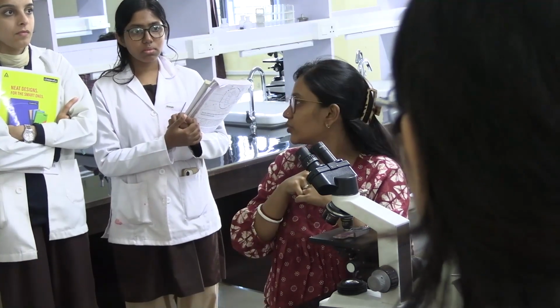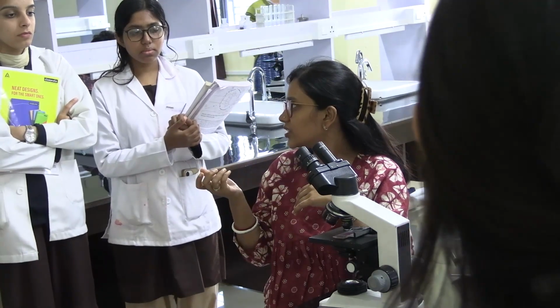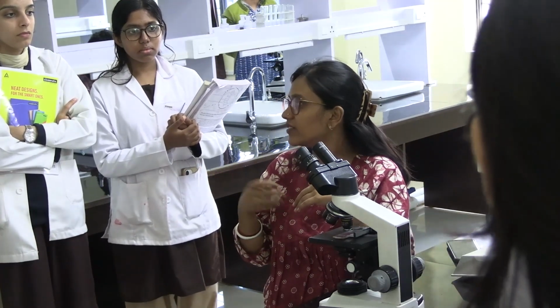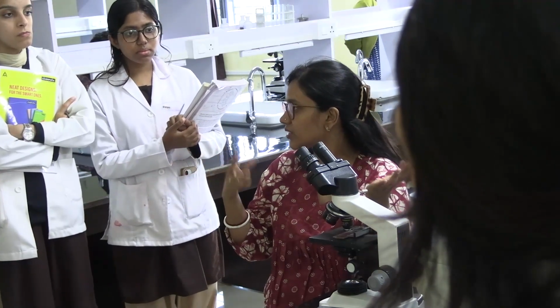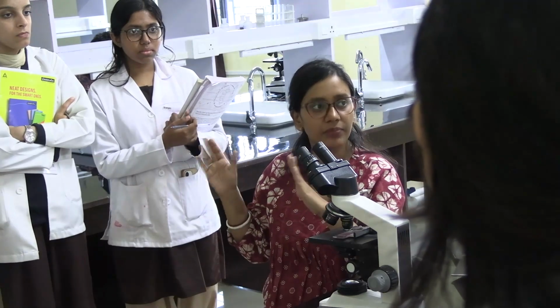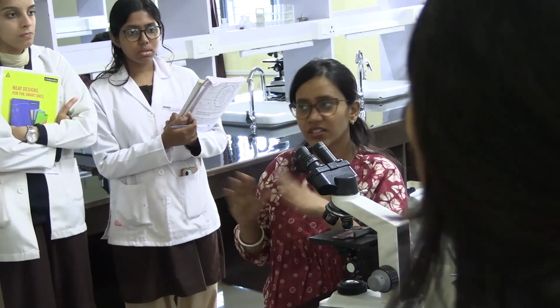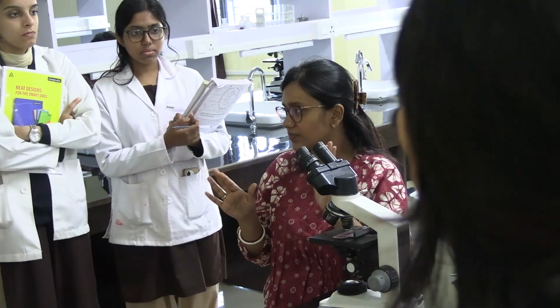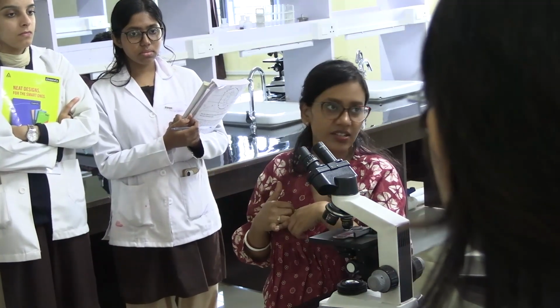Then that will refer to the increased NC ratio, right? When the nucleus becomes enlarged, nucleomegaly, then the NC ratio is going to increase. The nucleus will become enlarged in comparison with the cytoplasm. We are talking about pleomorphism. Pleomorphism means varied morphology. So the cells are not similar to each other.